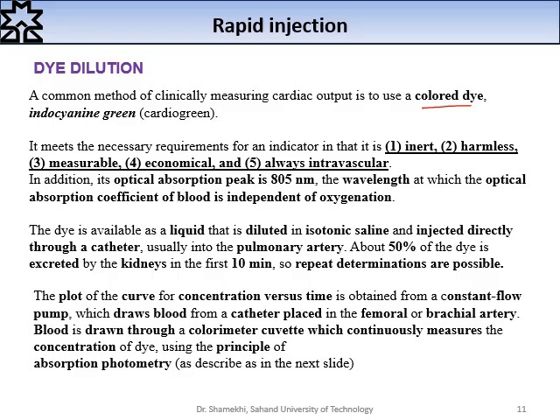In addition, in optical absorption, the peak is 805 nanometers, the wavelength at which the optical absorption coefficient of blood is independent of oxygenation.